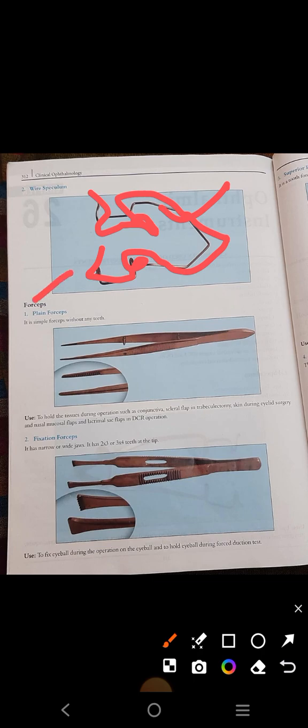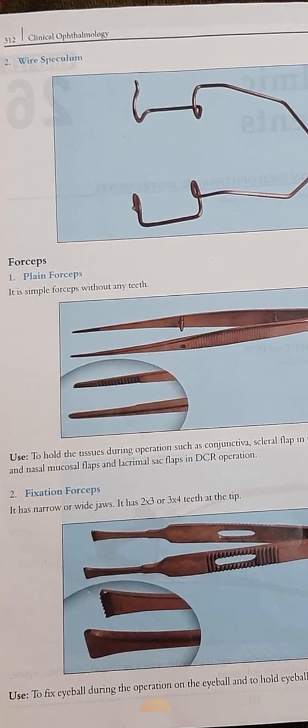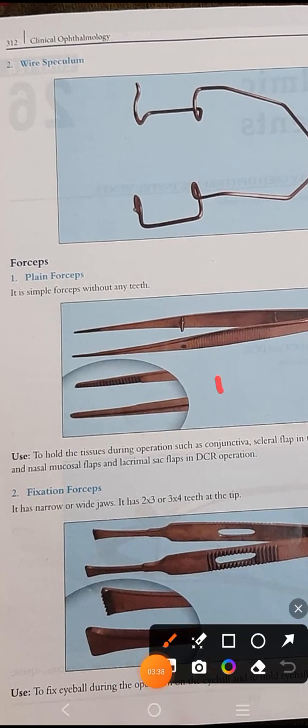Next are the forceps. Number one is the plain forceps. As the name suggests, it is very plain. It has two limbs; this is the handle where you hold it. On the central outer portion of the limb there are some striations for a better grip. At its tip, if you see the zoomed picture, you can clearly see that no teeth are present, only some striations.